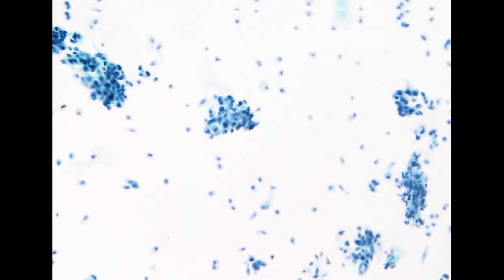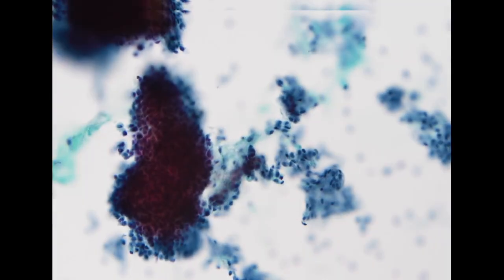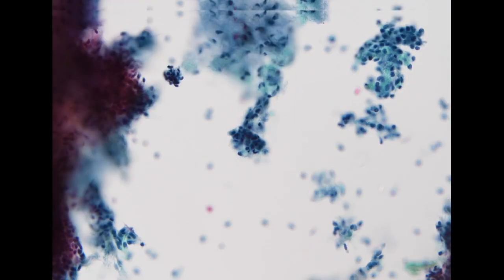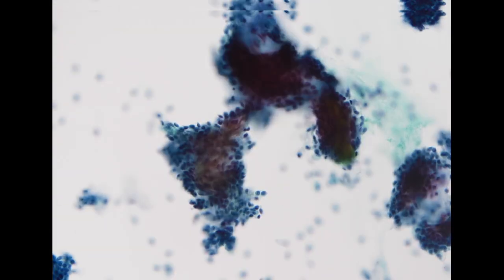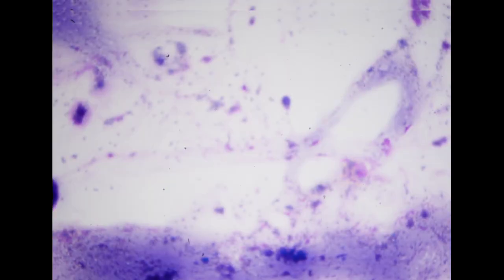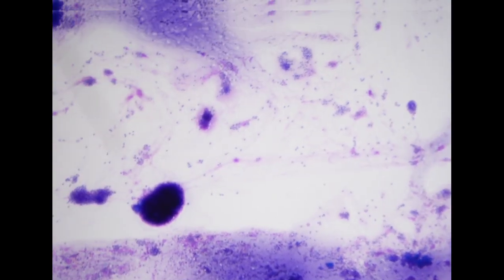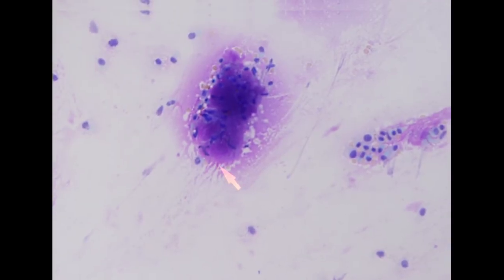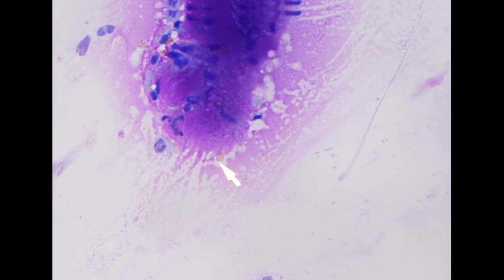So we have myoepithelial cells, we have chondromyxoid stroma, and sometimes we will also see clusters of cells with a ductal type of arrangement. If we see these three patterns together, this equals a pleomorphic adenoma. For the pleomorphic adenoma, usually we would like to see the direct smear with the Diff-Quik stain or Giemsa stain to look for the fibrillary matrix material, and it can be highlighted by this prominent magenta color.